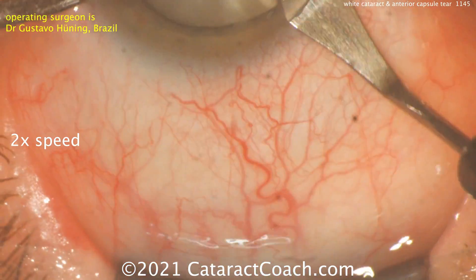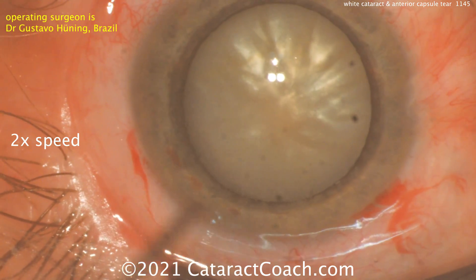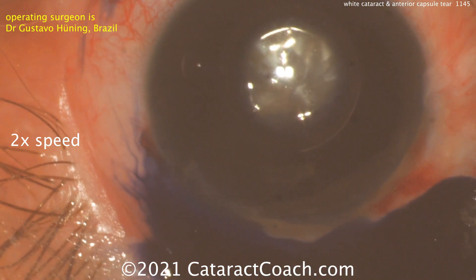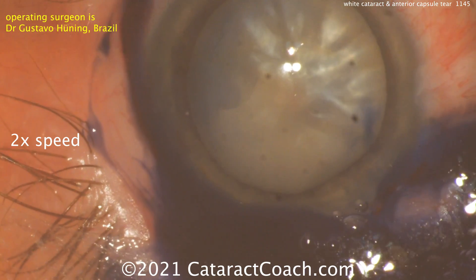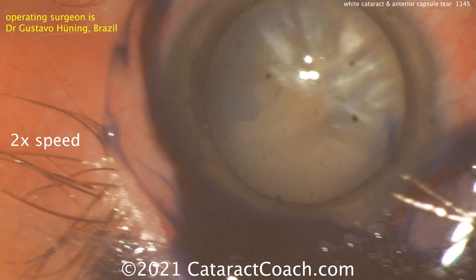We're going to speed the video up two times the normal speed. There's the paracentesis, there's the main incision, and you can see this is a white cataract. There's some pearlescence to it — that tells me it's probably intumescent and going to have fluid in there. So TriPan Blue dye is going in to stain the capsule, then putting in the viscoelastic.